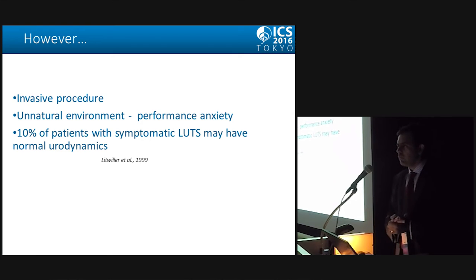However, we all know about the disadvantages. We know about the limitations of urodynamics. We know that it's not a natural environment with catheters, and so there certainly is a bit of anxiety to perform as a scientist or a nurse or a doctor will command. It's not normal to be peeing with tubes in both orifices down below, which itself can influence a test. And on the other hand, 10% of individuals who have symptomatic lower urinary tract symptoms may have normal urodynamics. And it is an invasive test. There is always a risk of complications and urinary tract infections, even in the best of hands.